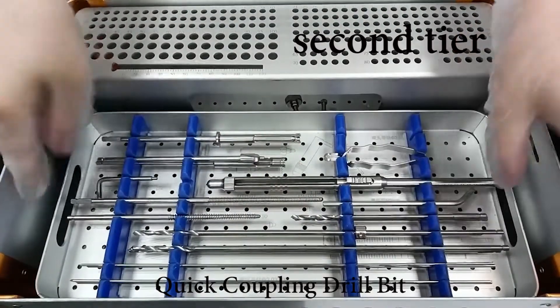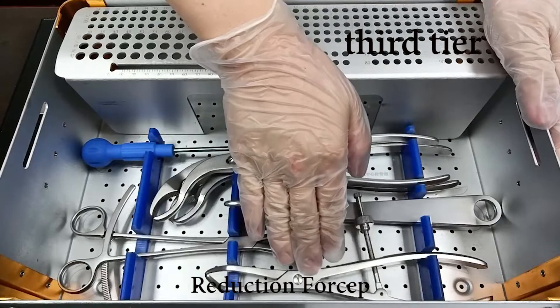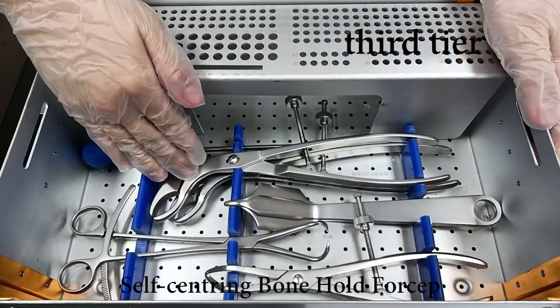Additional instruments include the quick coupling drill bit, reduction forcep, and self-centering bone hold forcep.